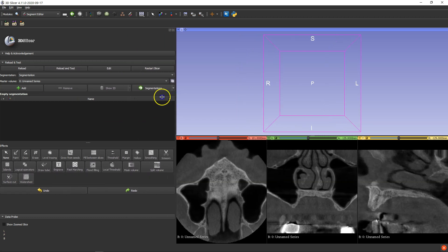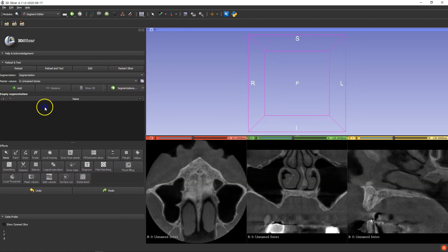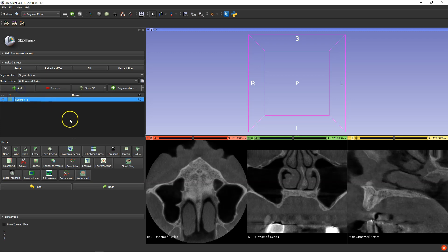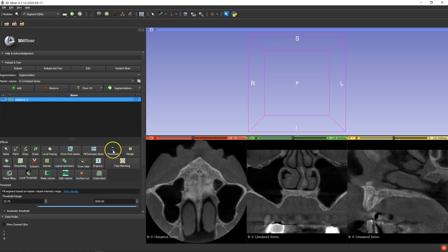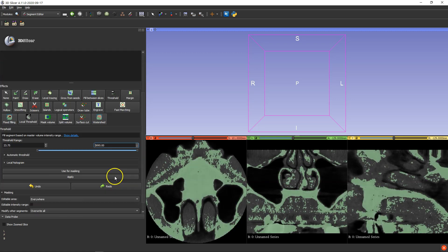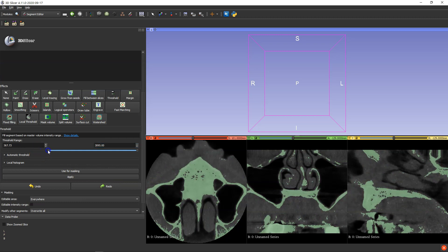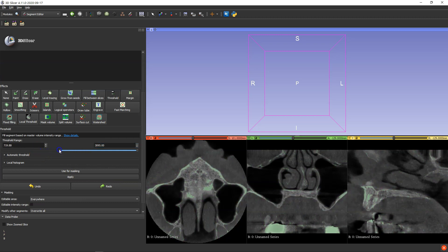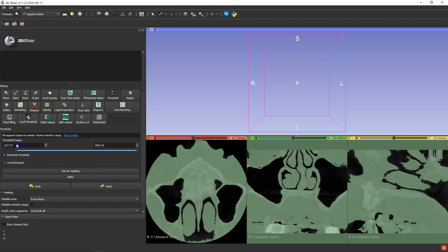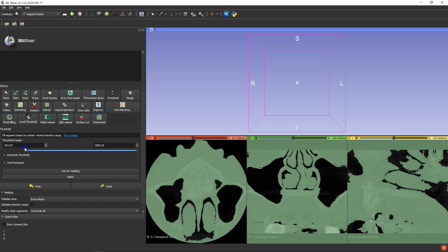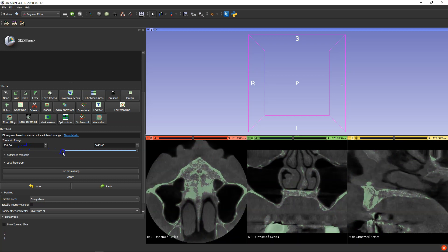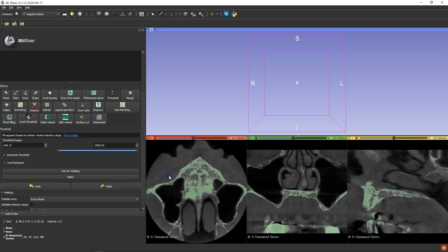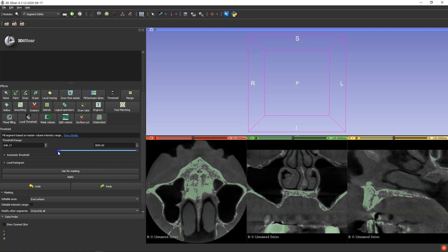Then what we're going to do is add a segment. In the segment we're going to click on threshold, and then we've got a slider. We're going to slide this so that we don't have too much noise but yet we have a proper decent outline of the DICOM.